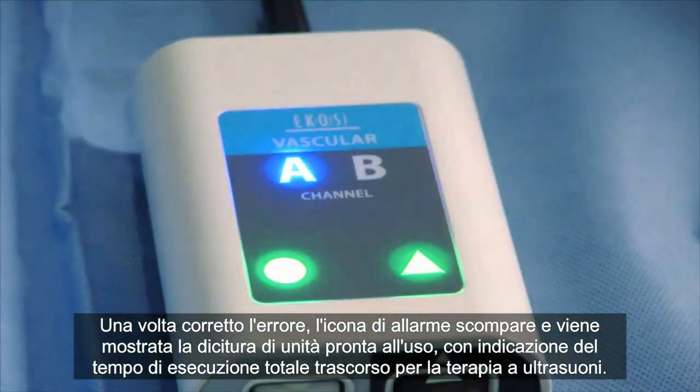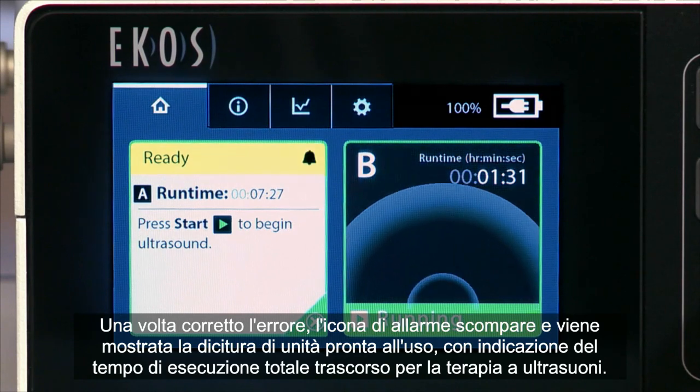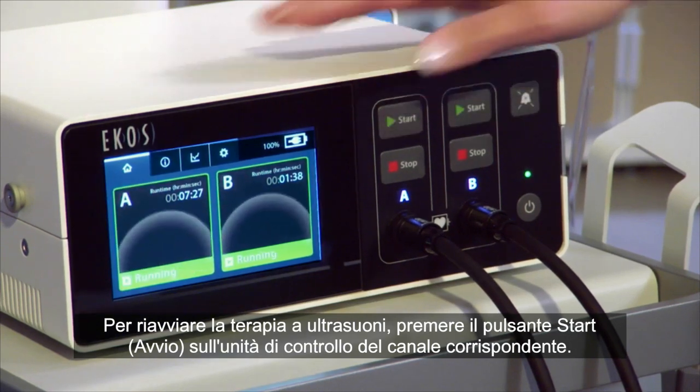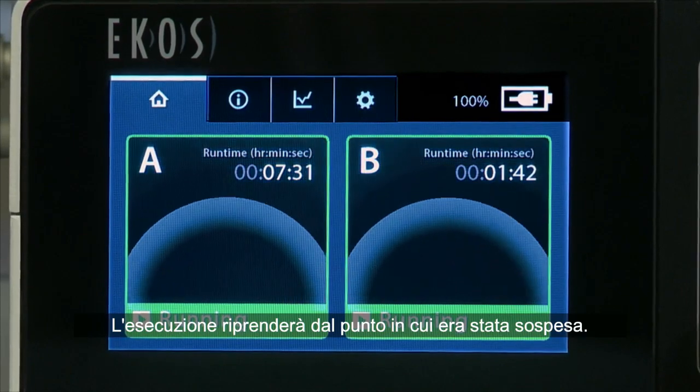Once the error is corrected, the alert icon will disappear and the Ready to Start instruction is displayed, indicating the total elapsed runtime for the ultrasound therapy. To restart the ultrasound, press the Start button on the control unit for the appropriate channel. The runtime will resume from the time at which it was stopped.